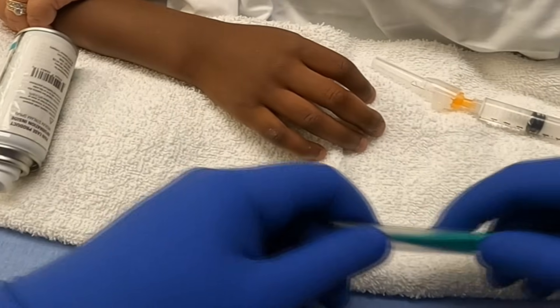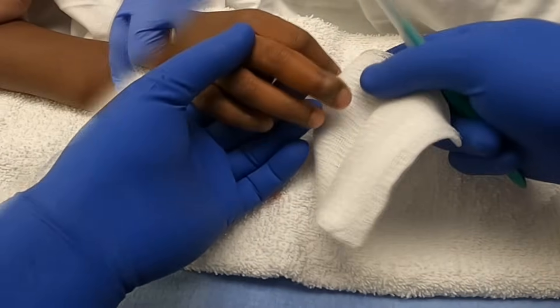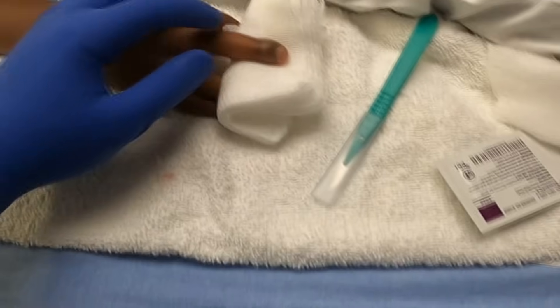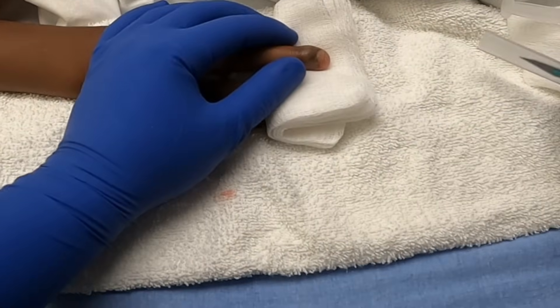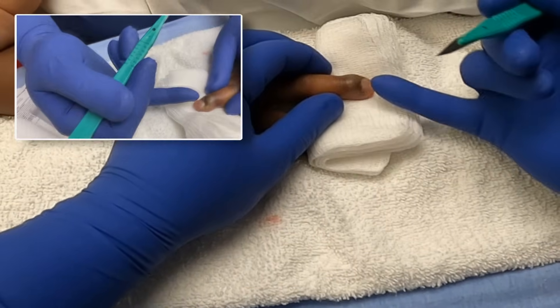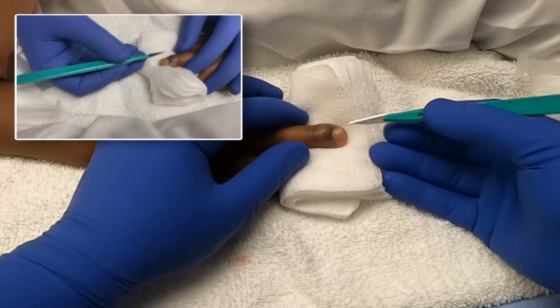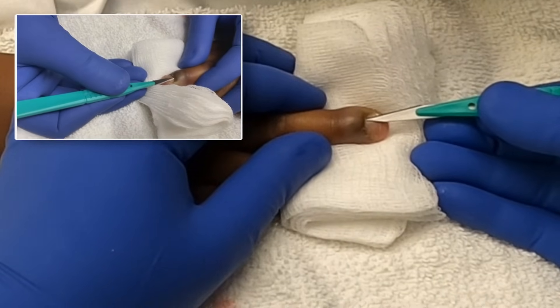We'll use a number 11 blade for the actual drainage. Okay, take some breaths so you don't throw up. You can see more of the infection on this side than on this side, so we'll direct our blade that way. Just try to prop up the finger and keep it flat and parallel.